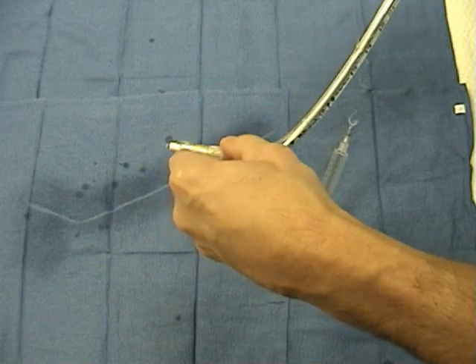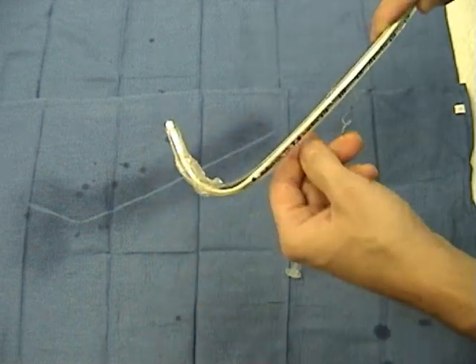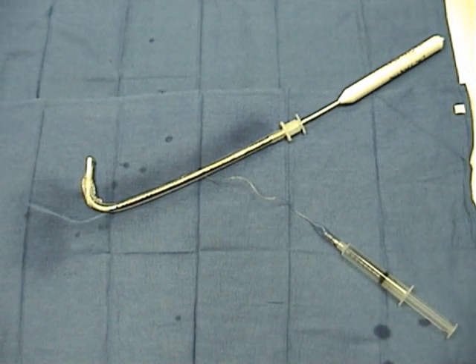We do the appropriate bend of the stylet to facilitate its entrance — around 110 degrees, sometimes a little more, even 120 degrees — approximately five centimeters from the tip of the lighted stylet.